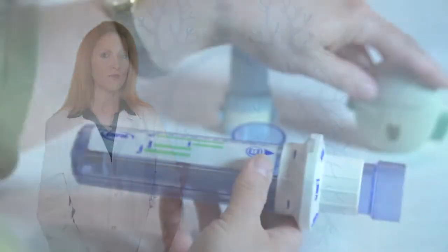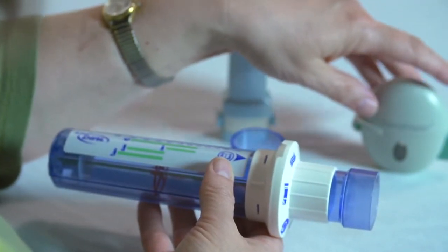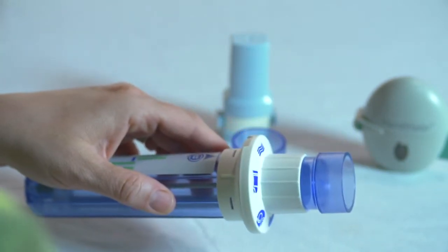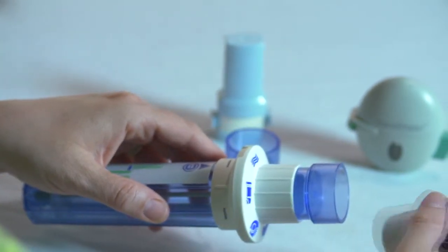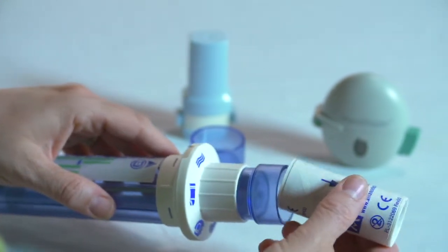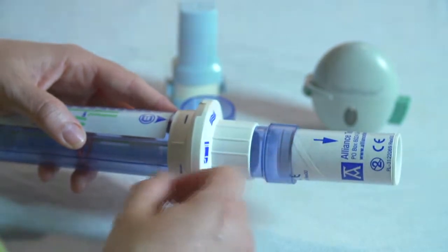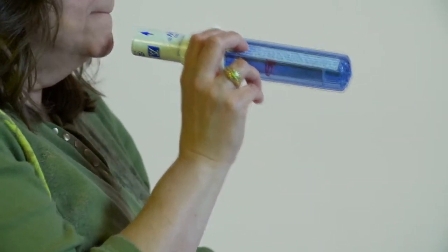To use the InCheck Dial with the Aerolizer, Twisthaler, or Handihaler, align the arrow on the mouthpiece with the free flow or wavy lines. Then insert the appropriate adapter. Insert the disposable mouthpiece into the adapter with the arrow pointing outwards. Then use the same technique as described earlier.